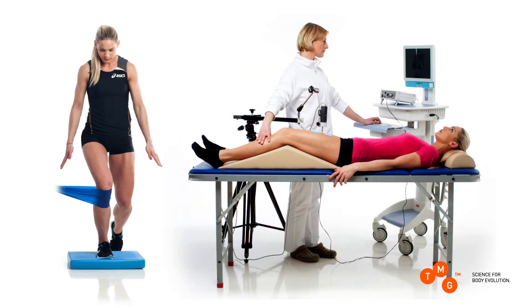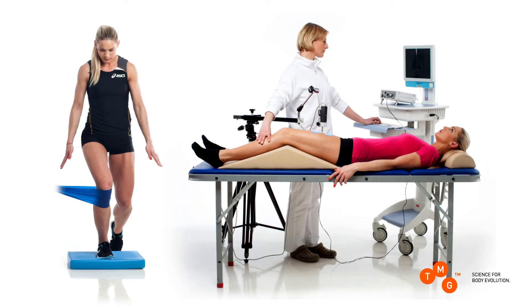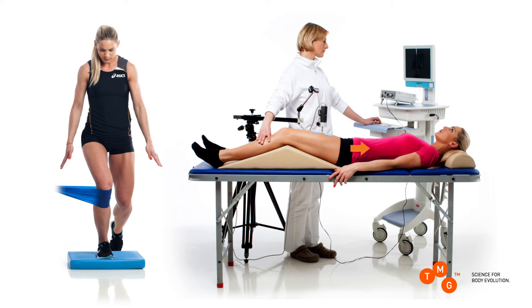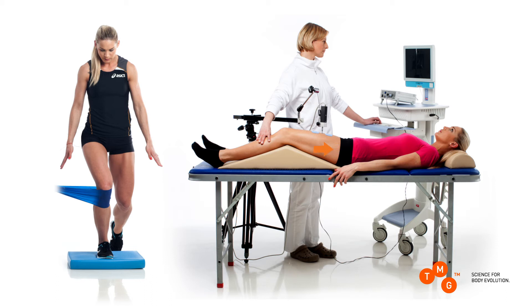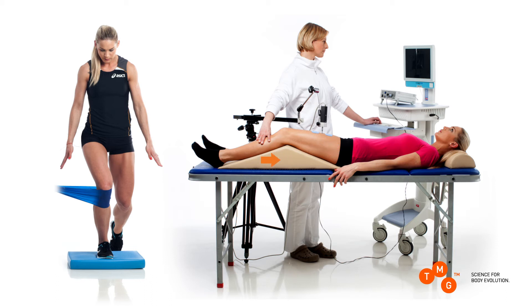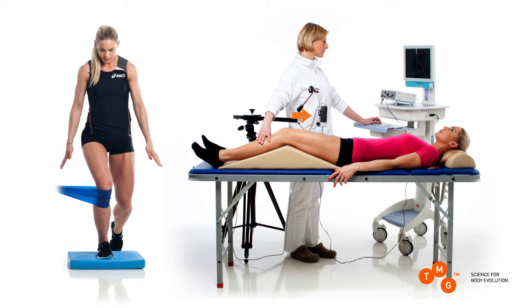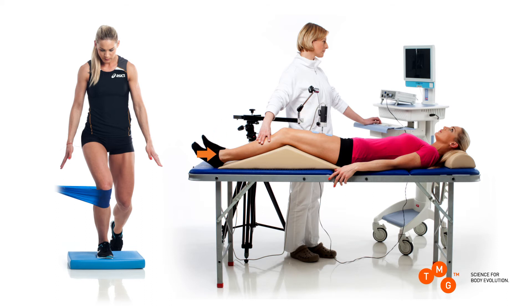To make measurement conditions easy and repeatable, few accessories are needed. The subject is placed on a massage table either on the stomach or back, with support pads placed under joints for designated joint angles. A sensor is held in a fixed position over the muscle belly by the support of a camera tripod and medical arm.